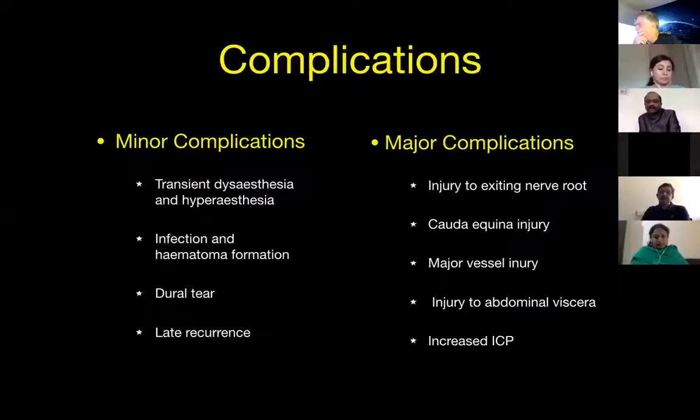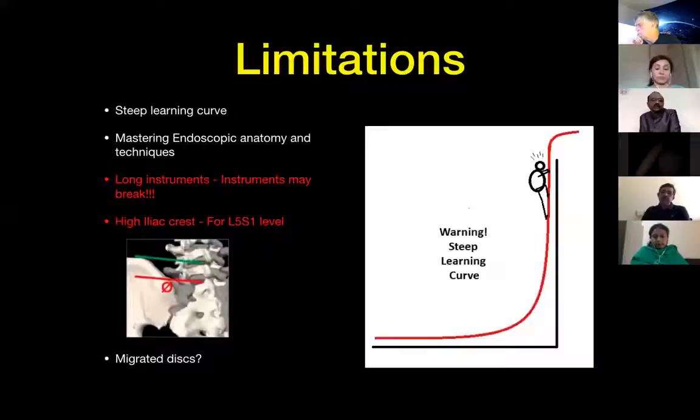What are the limitations of this technique? There is a steep learning curve. Mastering the endoscopic anatomy and techniques is mandatory. The instruments are quite long, around more than 25 centimeters in length. Since they are quite long, they may break while you handle them for the first time. So you have to be very careful when you use them.